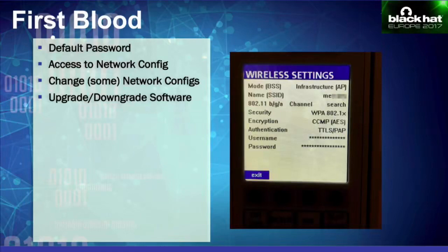It allowed access to a lot of network configurations. We could change some of the configurations, but not all of them. We also had an option to upgrade or downgrade firmware, but I'm not that technical, so it didn't go that route. We also noticed that there is an IRDA interface.